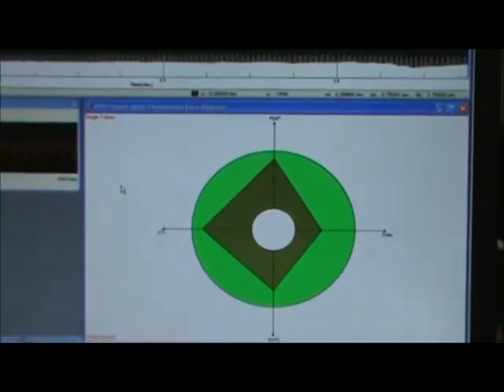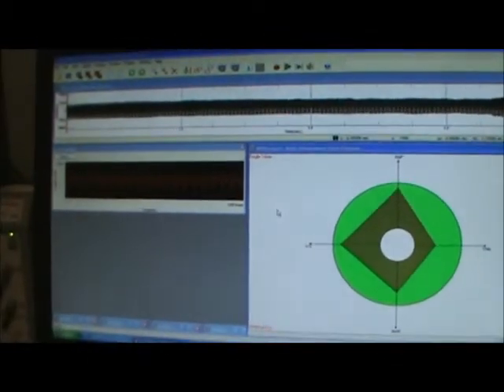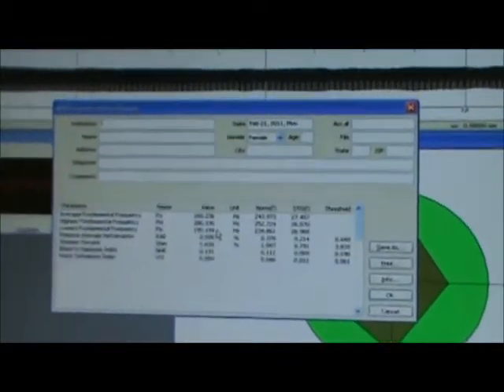Let's just do it one more time so you guys can see what it looks like when it wraps around. Of course, remember, I'm going to drop the camera to stop it. Okay, and I have a nice consistent sample that goes completely across the screen. So again, it's F7. And there's my graph, and you can see it was a better sample. Everything's within normal. If I want to see the actual numbers, I can hit F8, and it gives me that information. Okay? So that's the end of the demonstration.